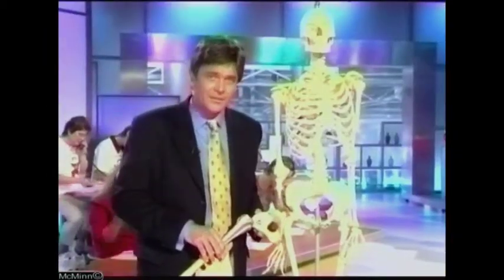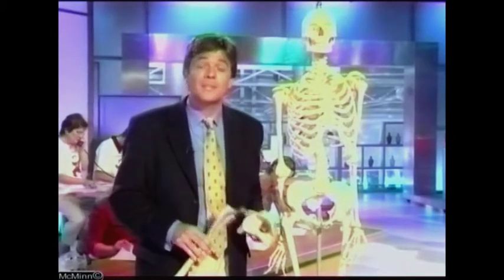1 in 10 of these operations fails after 10 years. And because of the amount of bone that's been cut away, this operation can only be done twice, and a second hip replacement has an even shorter lifespan than the first. Now there's an alternative to hip replacement that should last longer, making it ideal for younger patients.